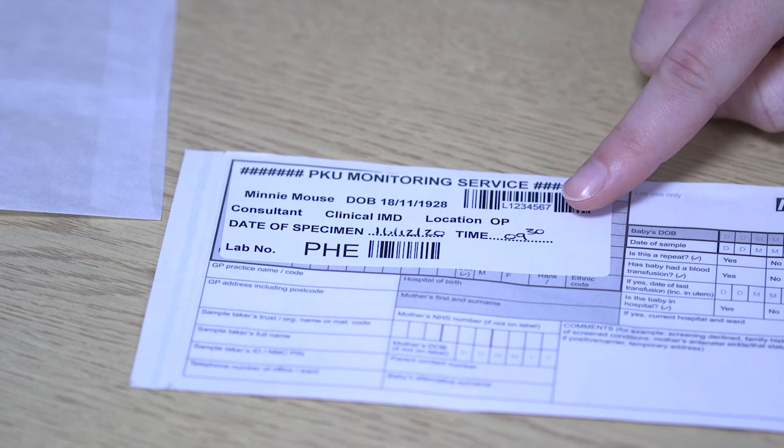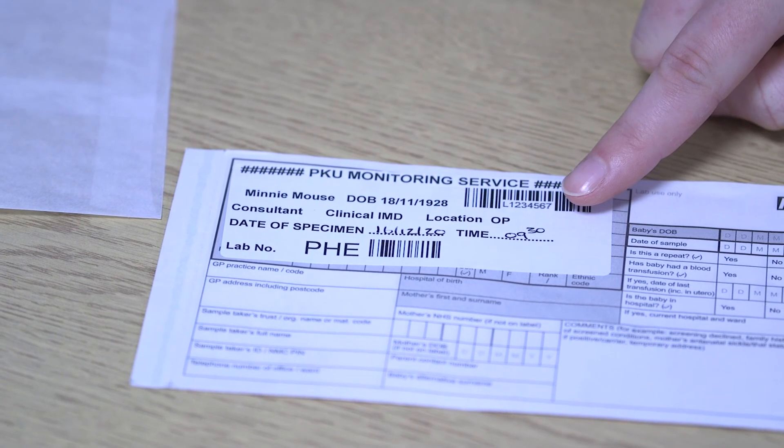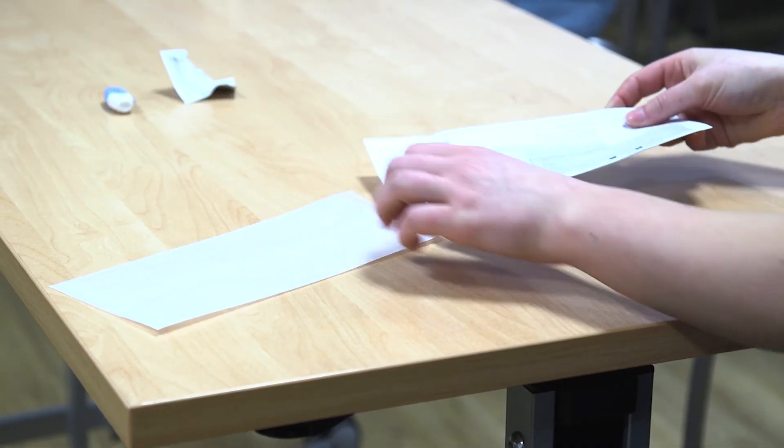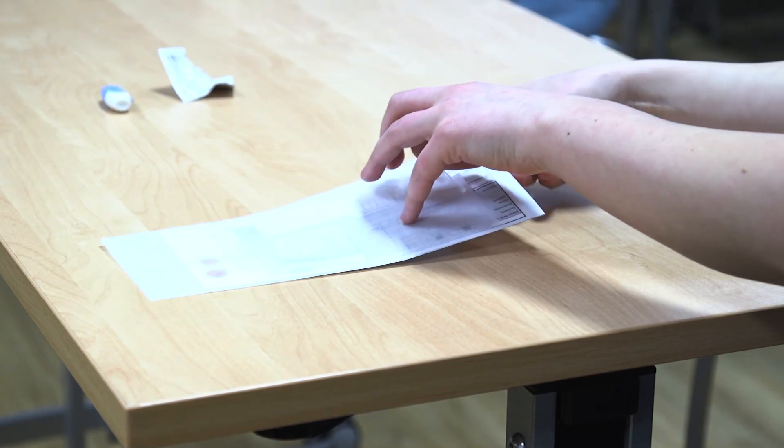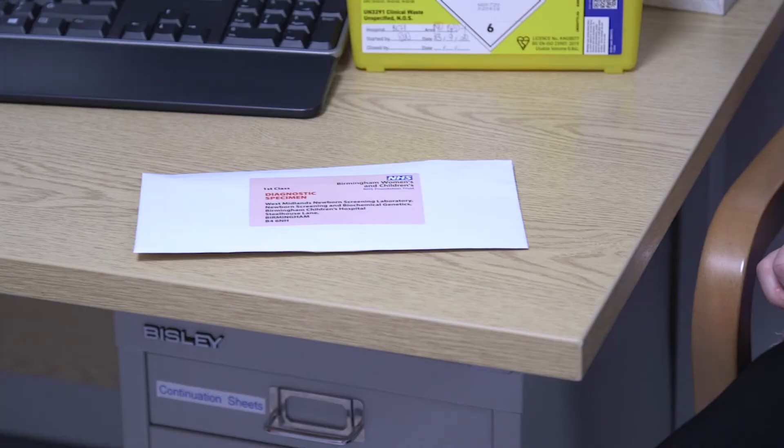Write the date and time on the blood spot card and place it into the clear envelope. Place the spot end of the blood card into the clear envelope, not the other way around. This then goes into the self-addressed envelope to be posted. Please ensure you have a first class stamp on the envelope so that it can reach the laboratory in a timely fashion.